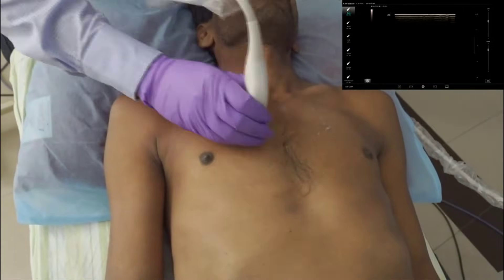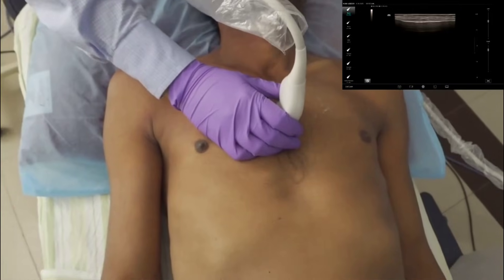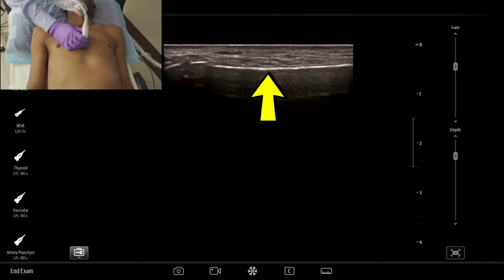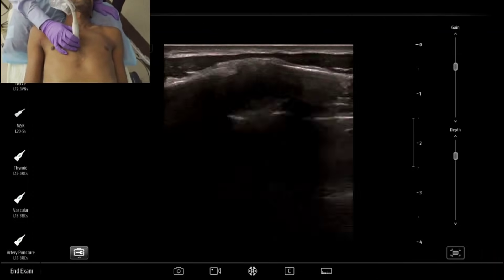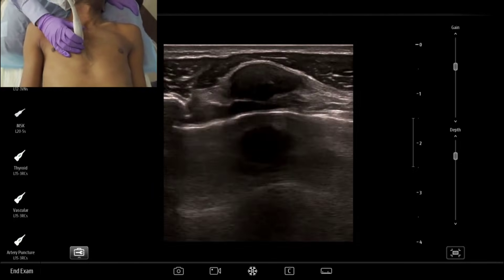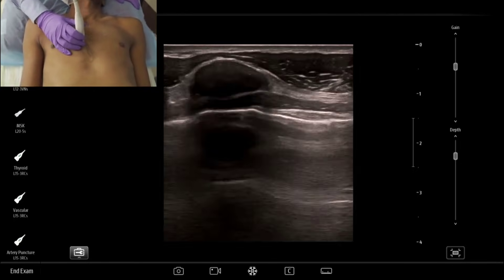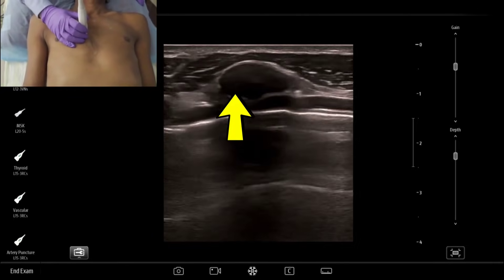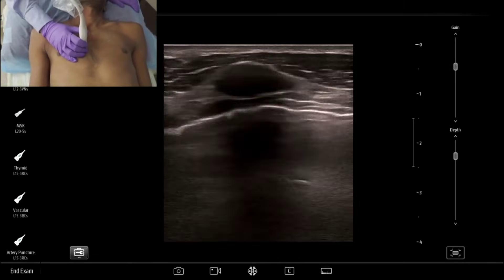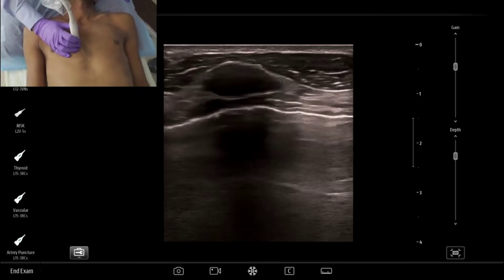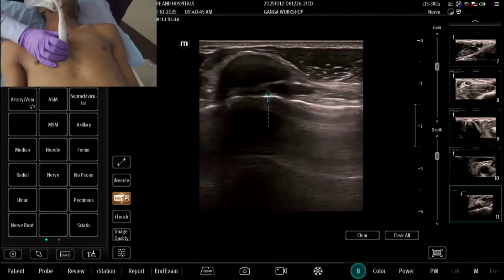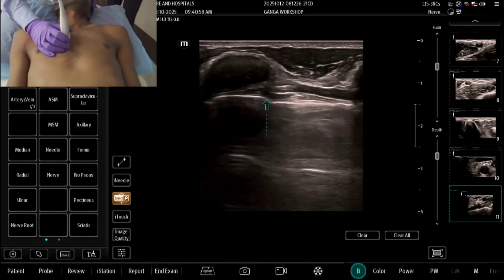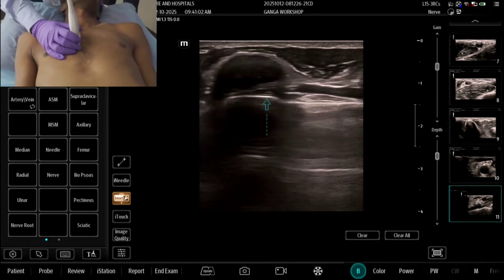First, just keeping the probe over the sternum — you see a bright hyperechoic solid line casting an anechoic shadow; that is the sternum. Now, I will keep the probe moving toward the lateral side. As I come laterally from the sternum, you can see an elliptical structure appearing — hypoechoic or anechoic — and you can see the posterior border also. Here is your pleura. This is the typical appearance of costal cartilage.